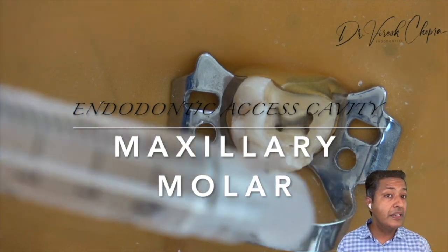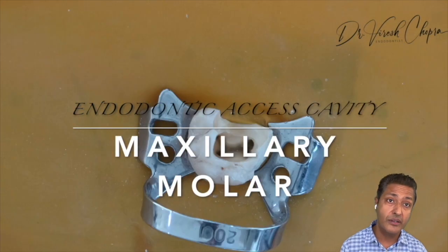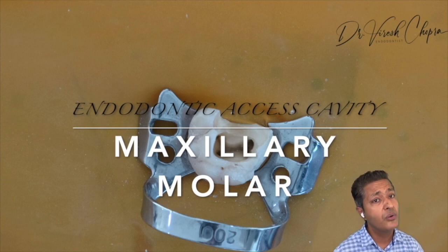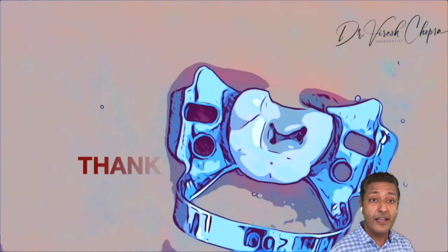So this completes us with an endodontic access cavity in a maxillary molar, and I hope that this video has been helpful to each one of us in making a proper access cavity and knowing how to locate an extra canal. Thank you so much guys.